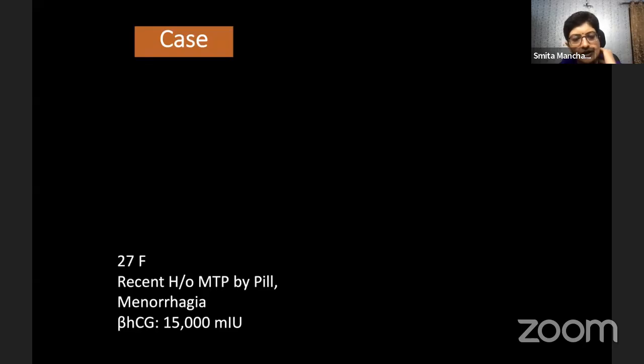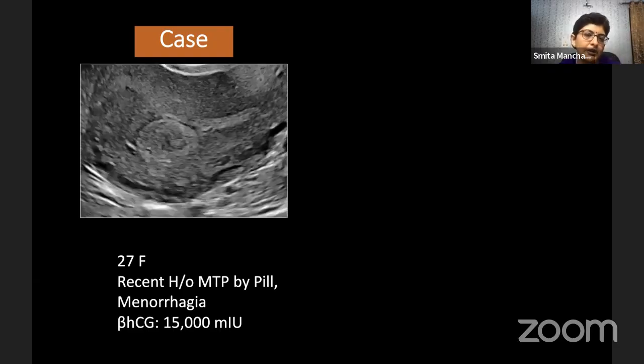Now another lady, 27-year-old, she had a recent history of MTP by pill, but now she's having menorrhagia. So the MTP was done only by medical management, and the beta HCG levels now done were 15,000 milli-international units. So now what do you see?